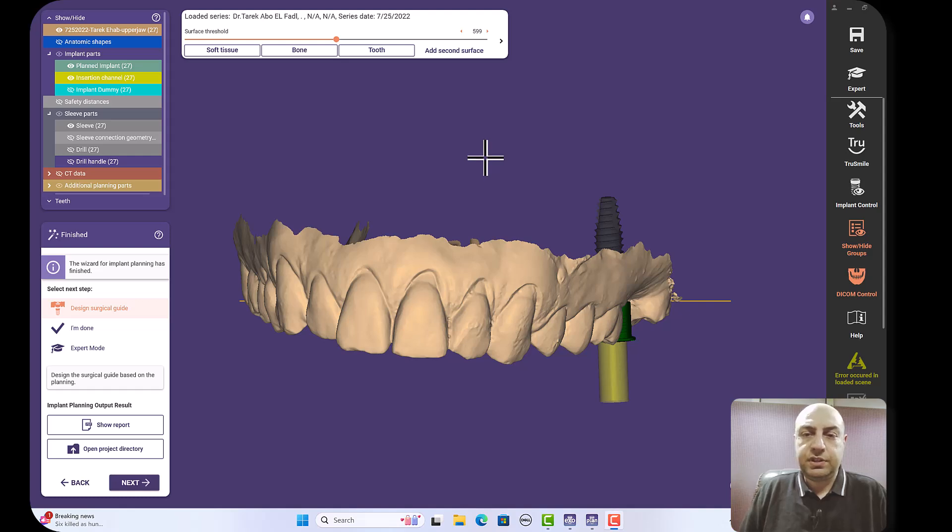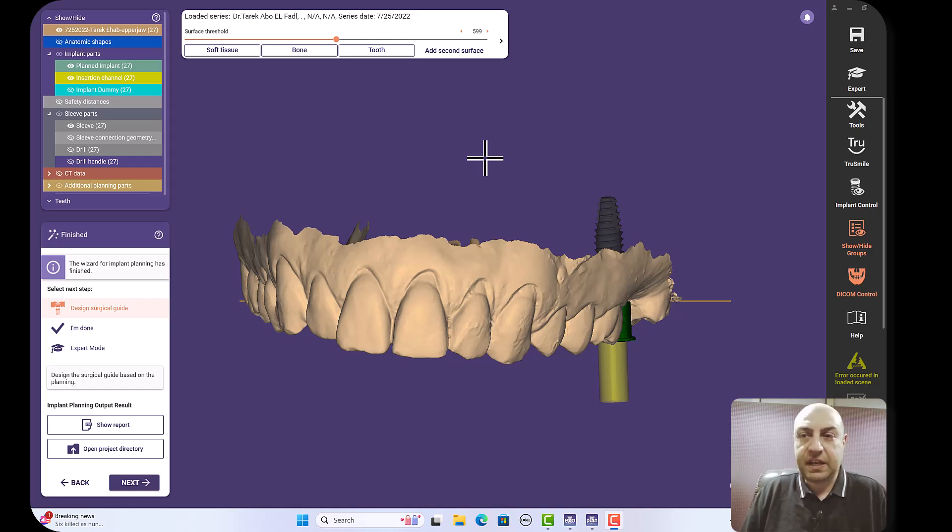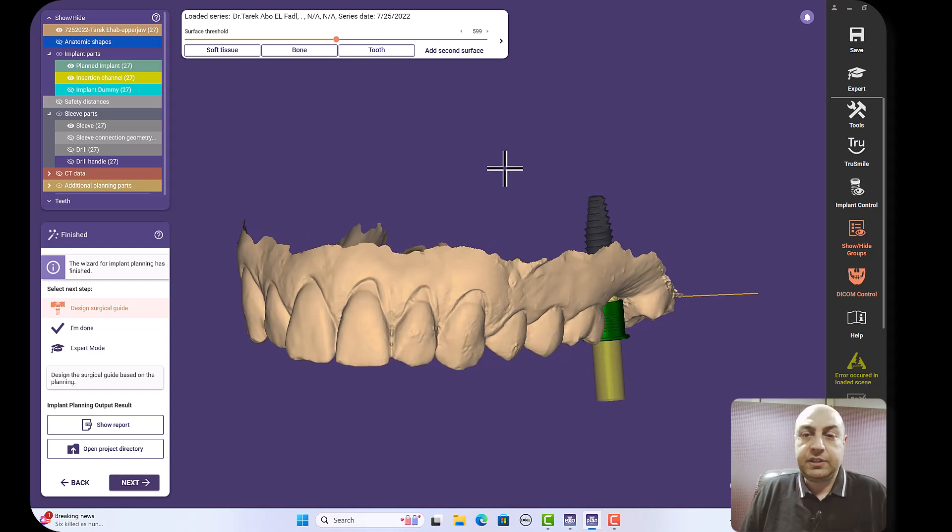One of the interesting features in Exoplan is that you can link it to Exocad software, which is a software responsible for designing the restoration.